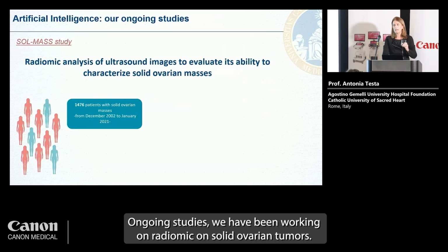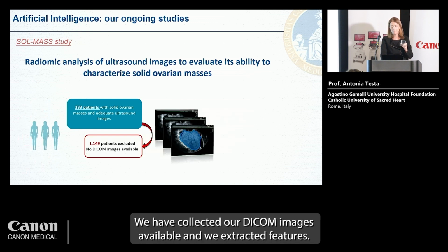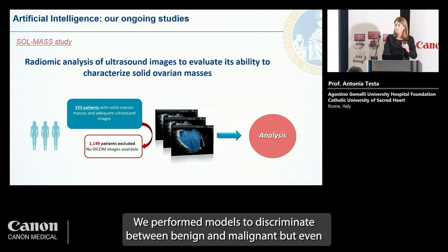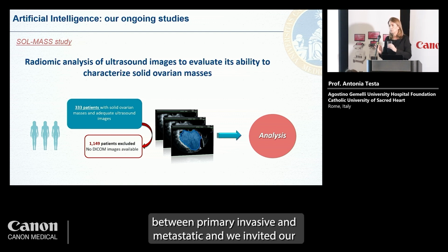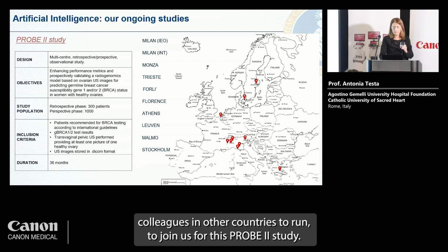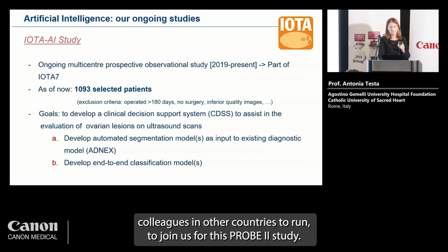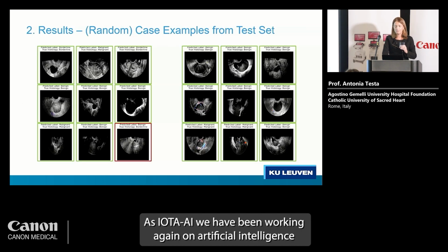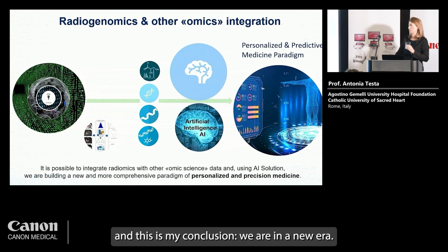Ongoing studies, we have been working on radiomic on solid ovarian tumors. We have collected our DICOM images available, and we extracted features, and we performed models to discriminate between benign and malignant, but even between primary invasive and metastatic. And we invited our colleagues in other countries to join us for this prospective study. So as IOTA AI, we have been working again on artificial intelligence, and this is my conclusion.